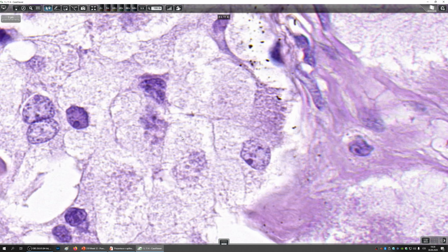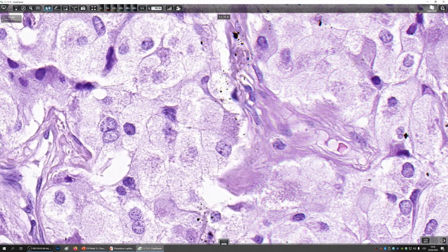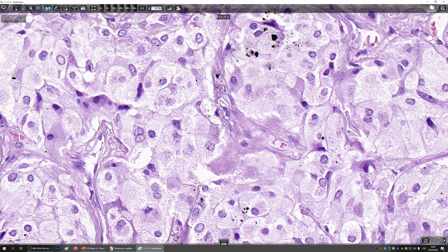These granulations that you see are the granules which contain the good stuff, the vasoactive mediators, adrenaline and noradrenaline. So the tumor can release a lot of adrenaline and noradrenaline, for example, when you touch it during surgery, or if you provoke the tumor pharmacologically.